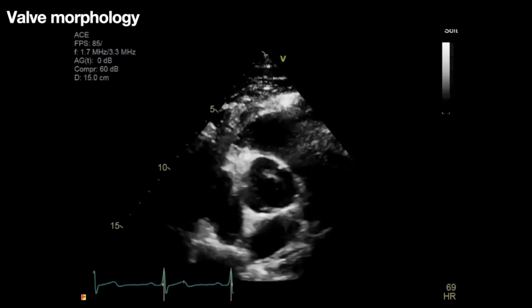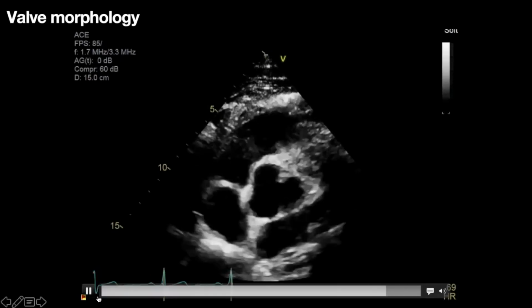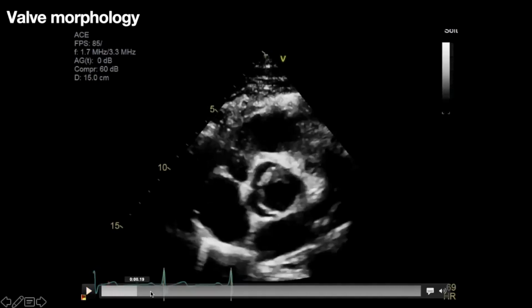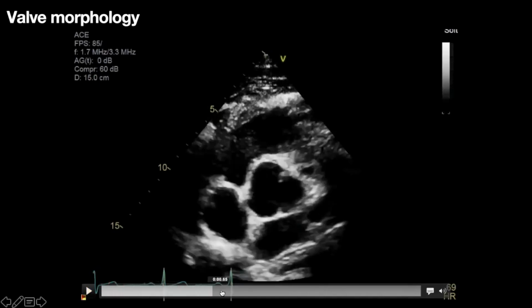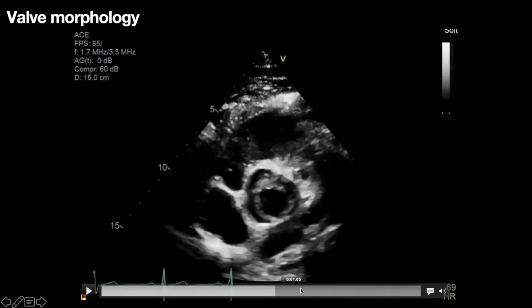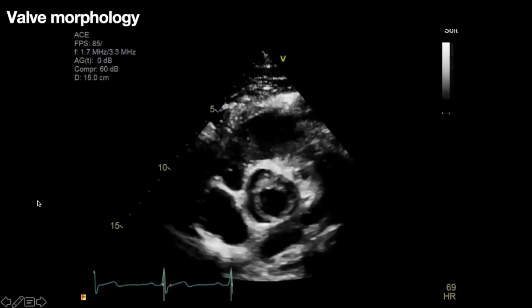Yeah, so I can slow it down for you. It's not going to help. The thing that I noticed here, oh, well, there you go.